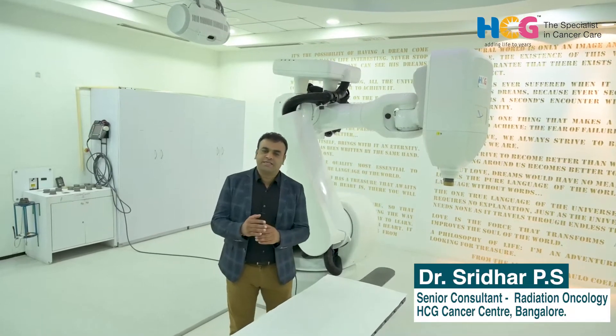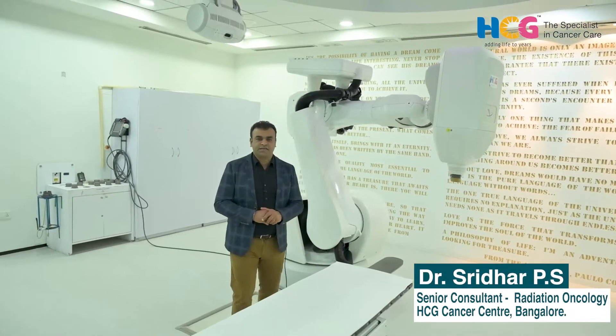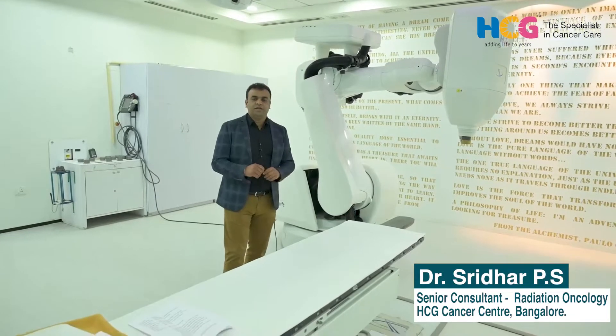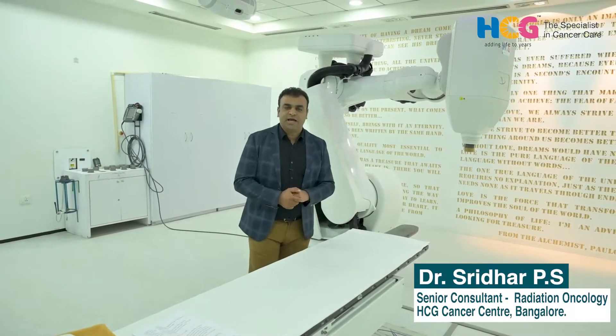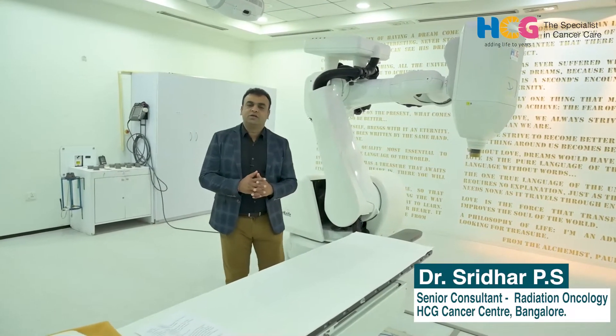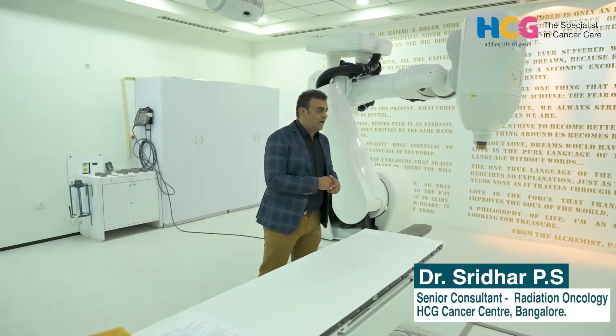When a patient is planned, we do PET-CT scan planning for all patients, along with CT and MRI-based planning. When the patient lies down on the couch with minimal immobilization, the system moves to exactly the target area, tracked with orthogonal X-rays with sub-millimeter accuracy — comparing the planning scans to the live position.